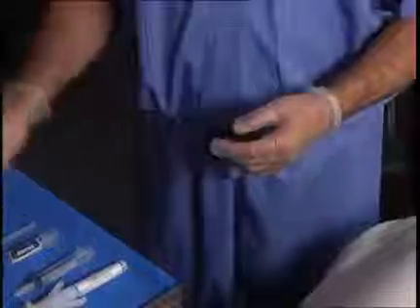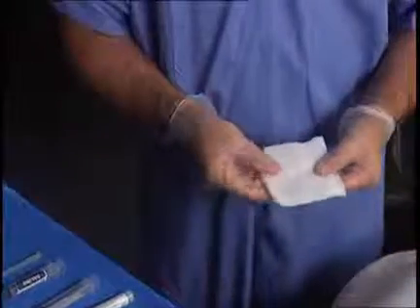The needle utilized to enter the space is a 3.5 inch spinal needle. For the conclusion of the procedure, it will be necessary to have sterile 4x4s for cleanup, and then a simple Band-Aid will suffice to cover the entry site.